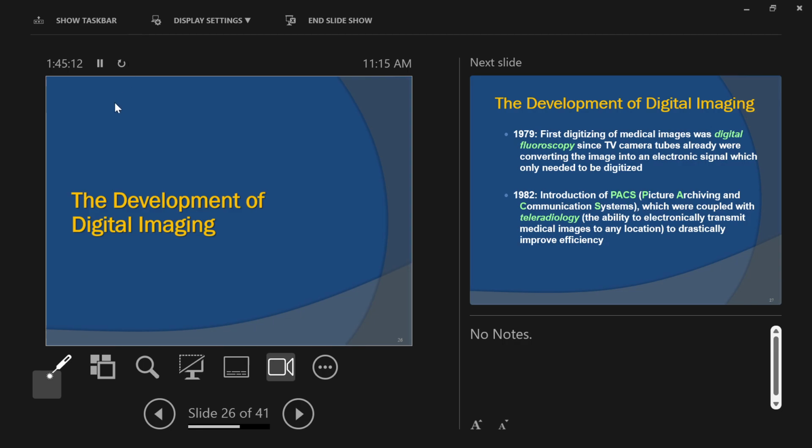That section of developments was just developments in imaging in general. What I want to cover from here forward for this next section is specifically developments in modern imaging, digital imaging. So what we mean by digital imaging is the images that we create are displayed, stored, transmitted, all of that done electronically, so all by computer interface.